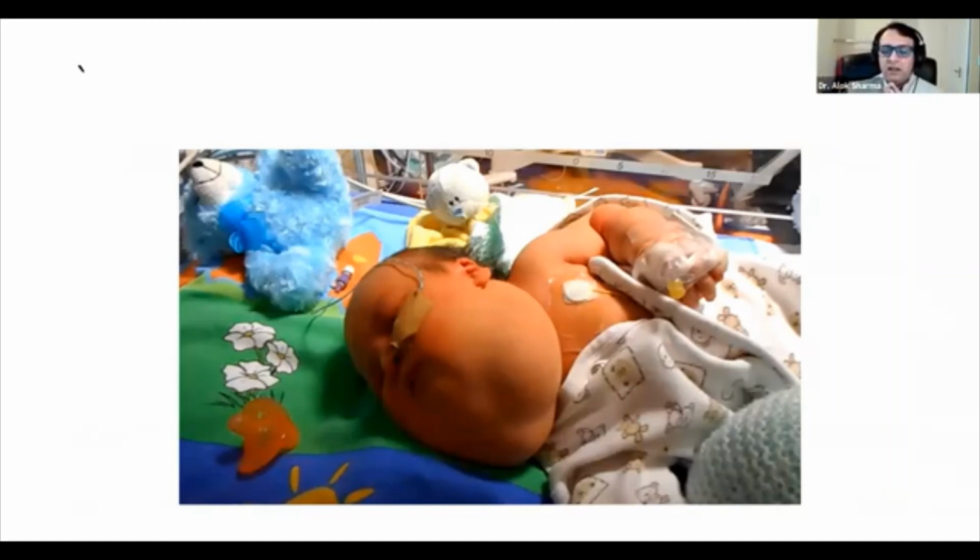Now, our intubation pathway for this baby was actually, do we need to intubate? Because if the baby comes out crying and has a stable airway, what we want to do is oxygenate, put this baby on high flow and let the baby adapt. But if we needed to intubate this baby, it's clear that would not be easy. So A, we decided to take a broad blade with us.